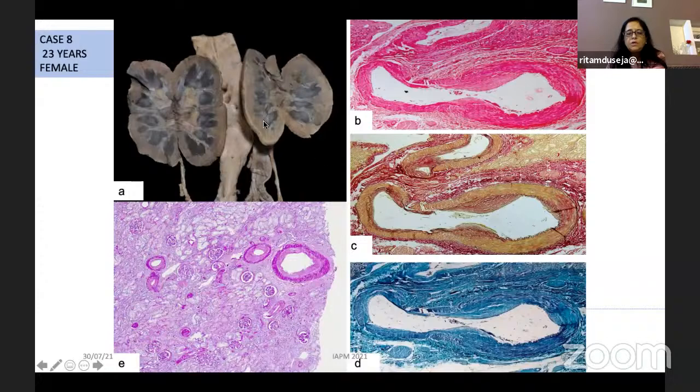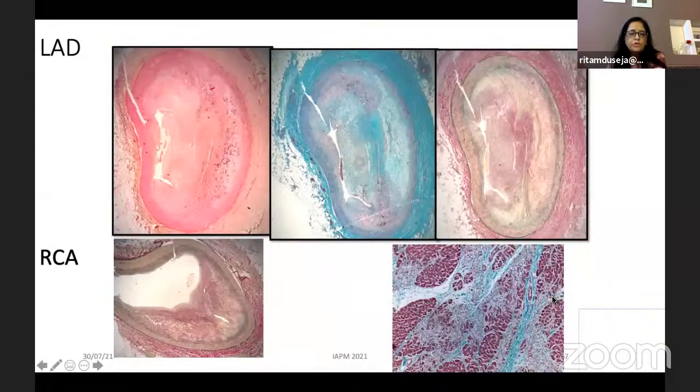Now coming to another medium vessel vasculitis, that is Kawasaki disease. Here, most of our material is autopsy material because we generally don't get to see that in biopsies. In a young female, if there is some evidence of arterial damage with ectasias, some rarefaction of media and some edema of the media, that is the only clue we are going to have. In the absence of atherosclerosis, why should a young lady have this kind of arteritis, this kind of luminal occlusion?